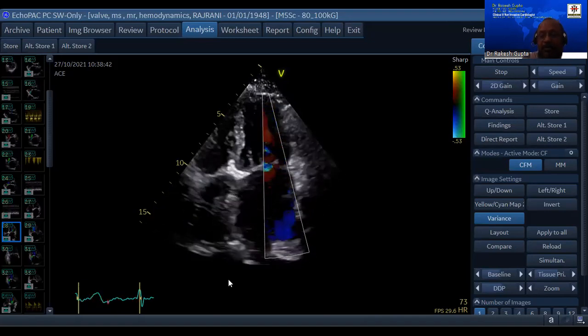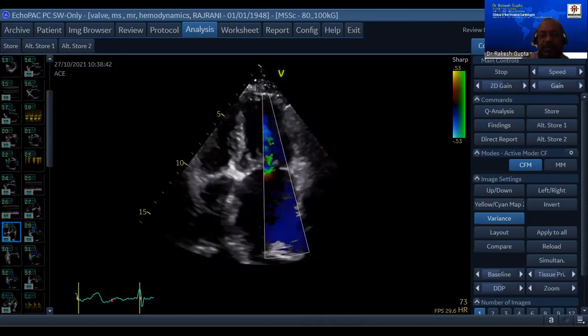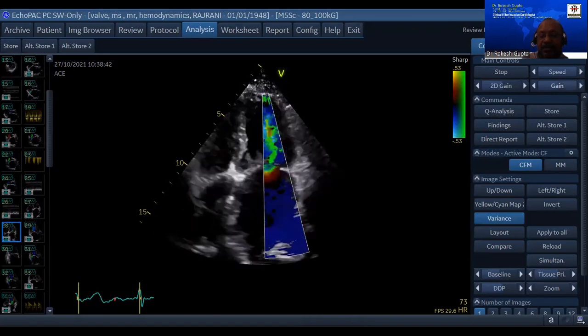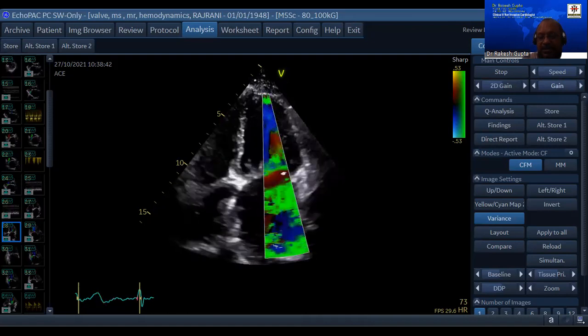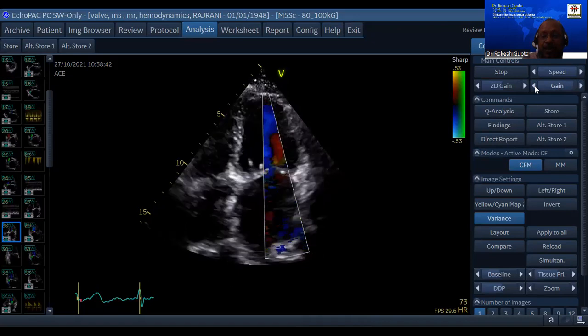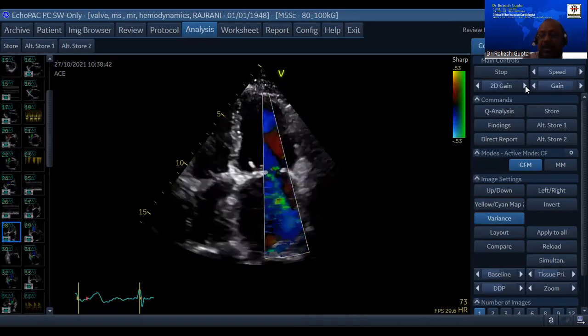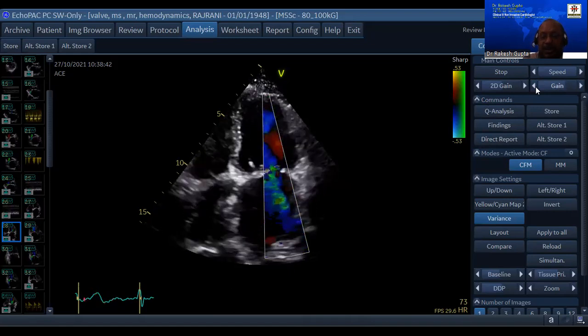I said all of them. Look, let me increase the gain. Now you'll see what happens. I'm increasing the gains now. What happened to MR? Increase or decrease? Increase. So when I was increasing the gains, a lot of colors were seen. The garbage color was seen. So I'm going to reduce it so that you can see no garbage.